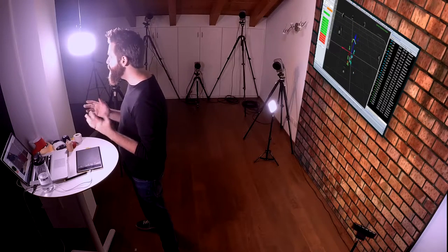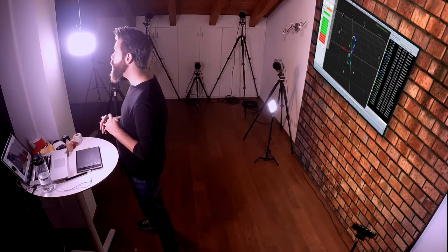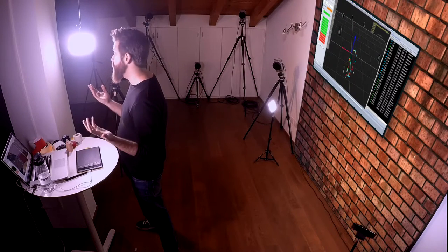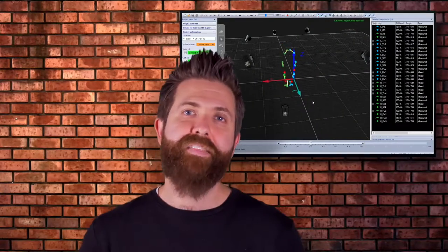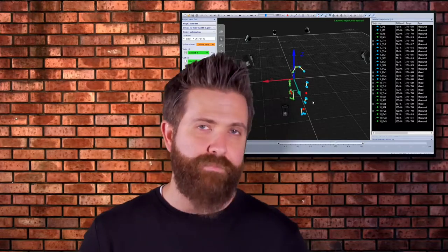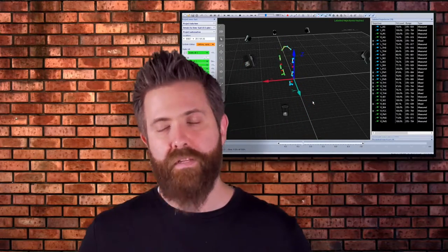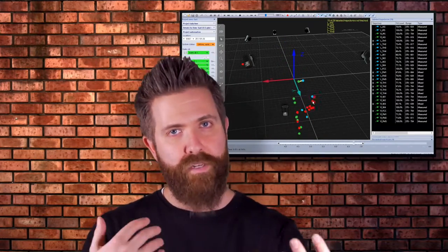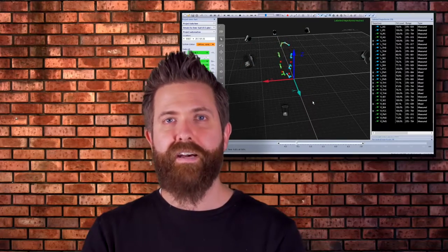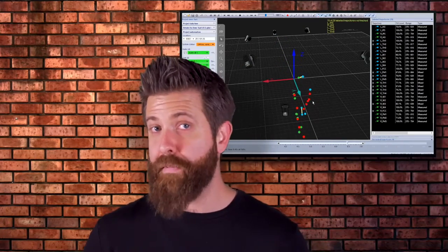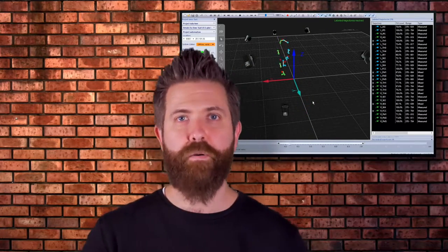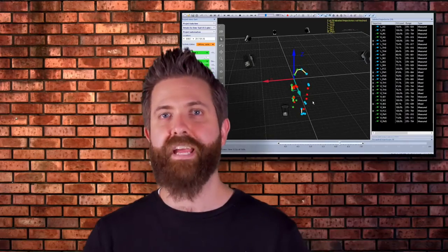Ideally you should be aiming to record five or more trials and then exporting at least three. Of course, the more you export, since the processing can be automated as we talk about in Visual 3D Basics in Visual 3D Export Builder, you could have any number and it won't cost you any extra time.